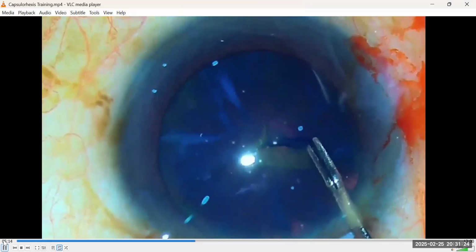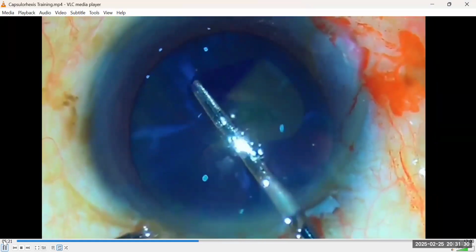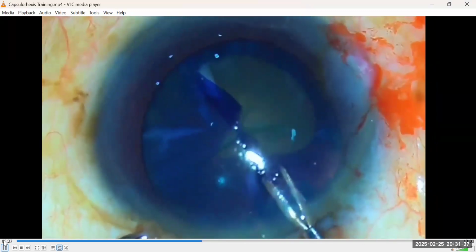Take a puncture as soon as it is possible. This took longer. All right, but now this is risky, what I did here. Don't leave a long flap. See what happened to me here. All right, so this is not my desired perimeter. It was going on by itself. So I now started using more centripetal work.